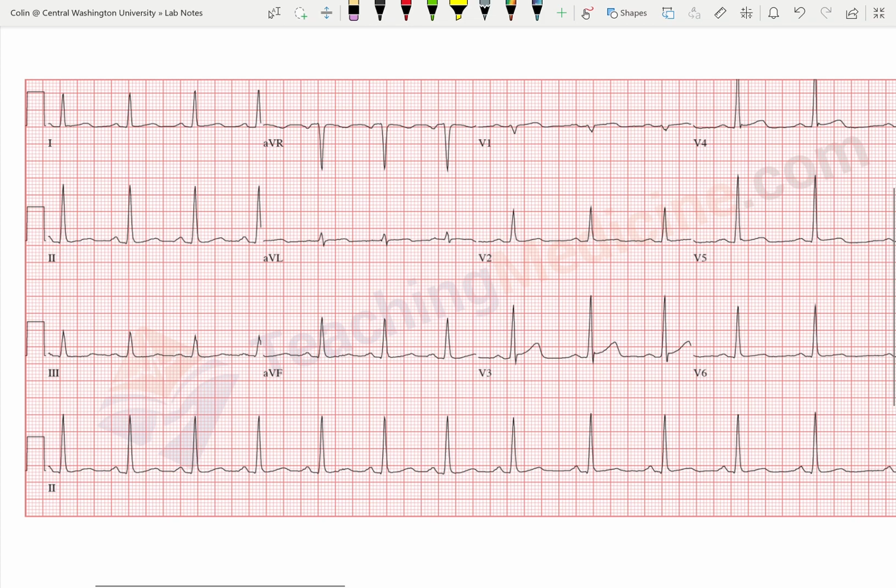If you're going to be a good paramedic, you need to understand all of this and be able to do it, because there's a lot of things you can find. But at a very basic level, if they have ST elevation, it's almost always the case that they're having a heart attack. So hopefully this wasn't way too much, but if it was, don't worry about it.